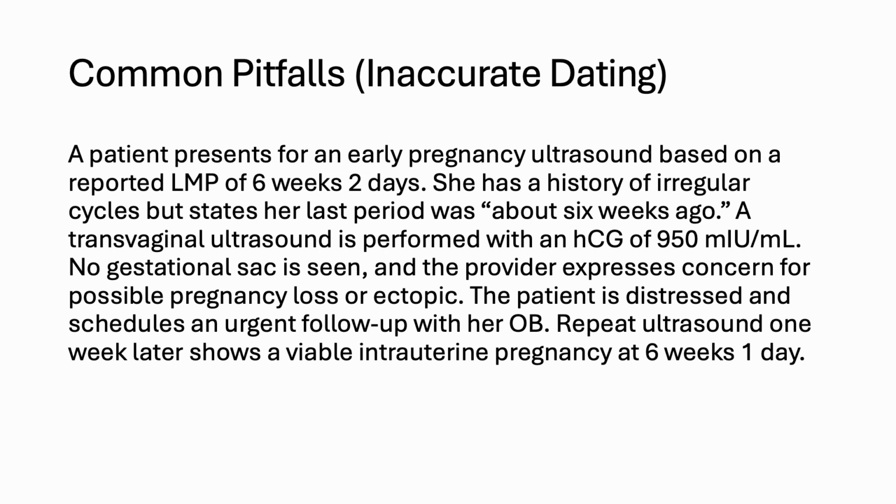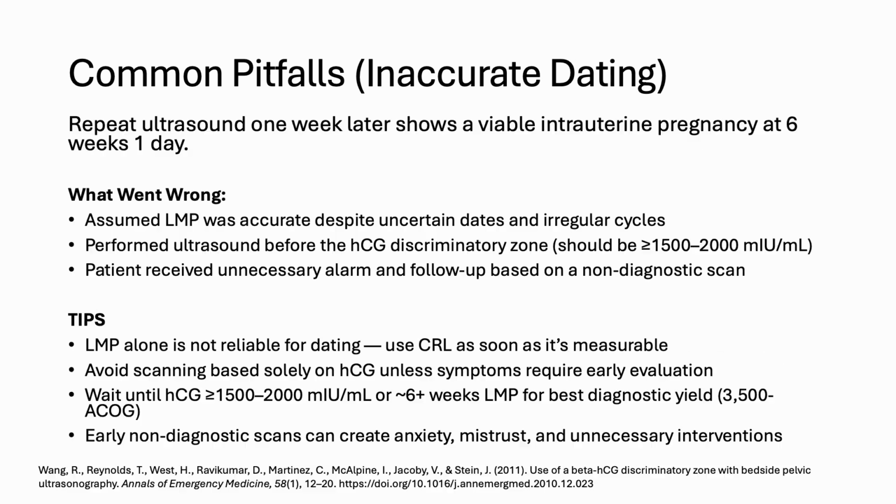And so it is very important to know the correlation with the HCG and what you would expect to see on ultrasound. I know you don't know this now, but anytime you do an ultrasound, you have to make sure, what is the whole clinical picture? Does she have regular periods? What's her HCG? Are you seeing just a really early pregnancy, or is it a loss? And if it's a loss, do we tell the patient for sure it's a loss or an ectopic, or do we need to evaluate further?